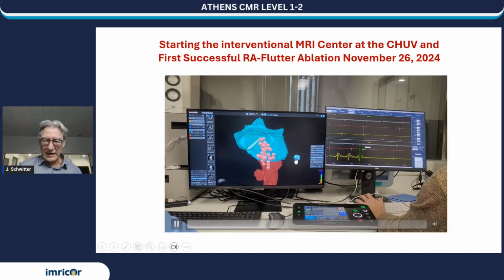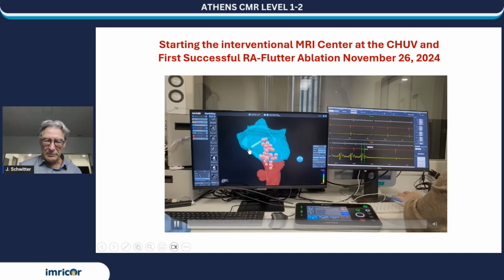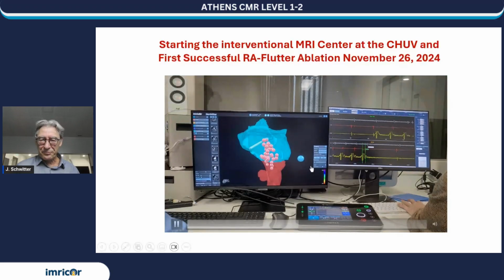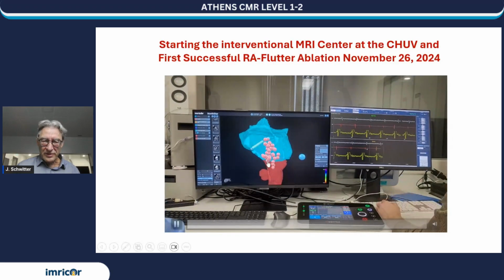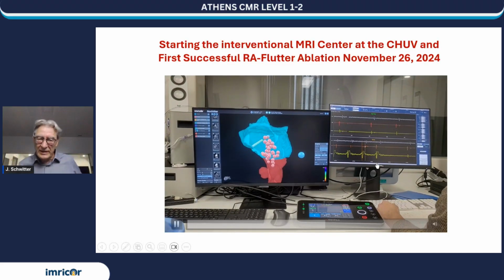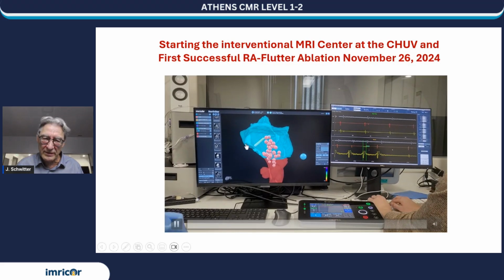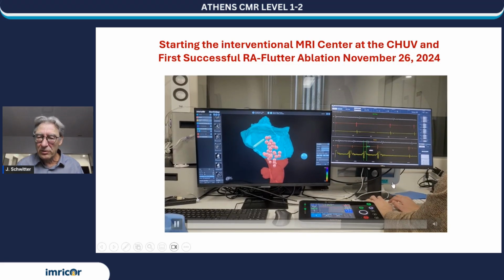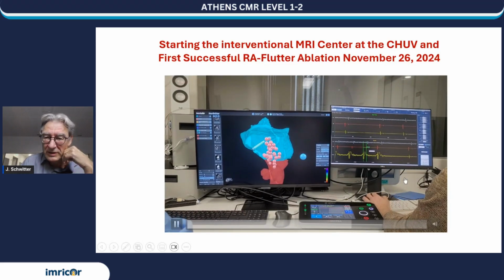In the beginning, you have a fast excitation going through, so there is excitation, and immediately you see the signal here. Now if this line is closed, the excitation will go around. So it will take more than 100 milliseconds or so between excitation and sensing the signal here. If you have more than 100 milliseconds delay time, we call that a positive result compared to the initial state.